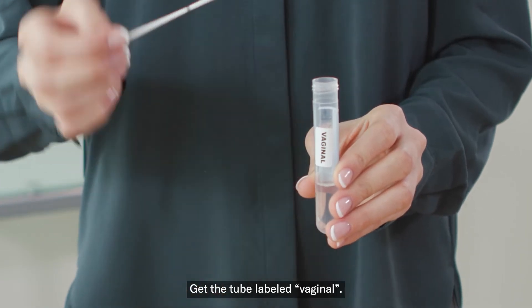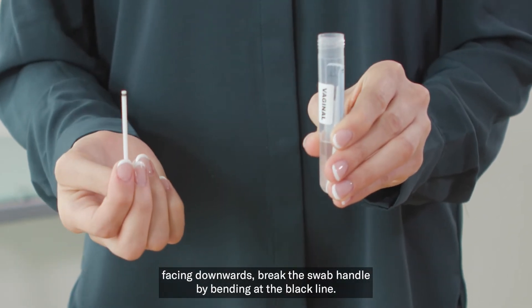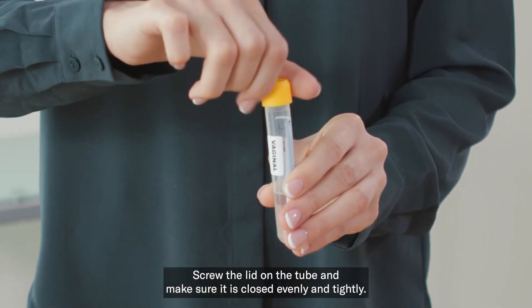Get the tube labeled vaginal, open the tube, and with the tip of the swab facing downwards, break the swab handle by bending at the black line. Screw the lid on the tube and make sure it is closed evenly and tightly.